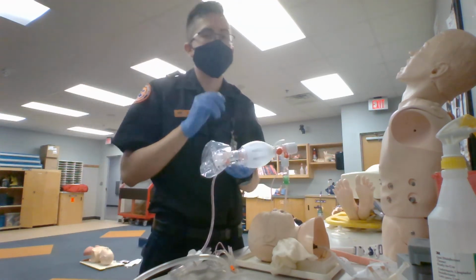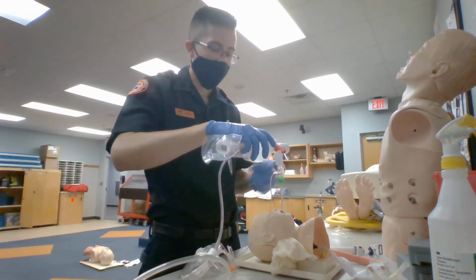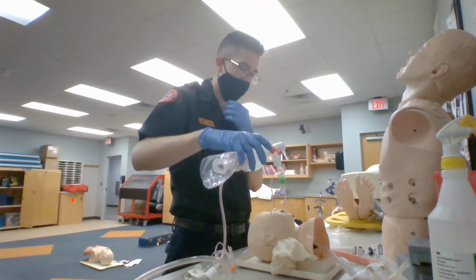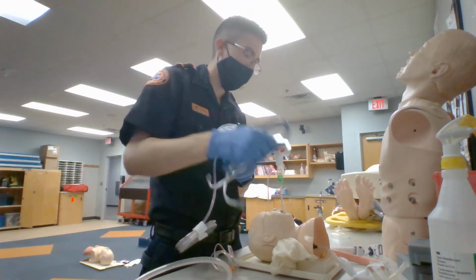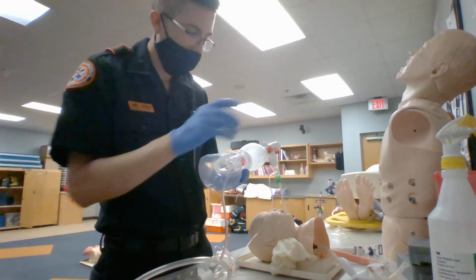As I was doing that, I would be assessing for signs of hypoxia. I'm also going to watch their SpO2, their capnography to make sure that I have proper placement, see if there's misting in the tube. I will continue to ventilate my patient 10 to 12 times a minute. I am also going to do a secondary confirmation of the tube placement by auscultating over both of the lungs as well as the epigastrium.